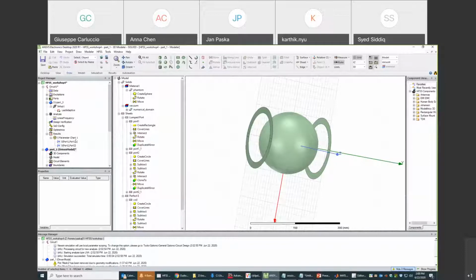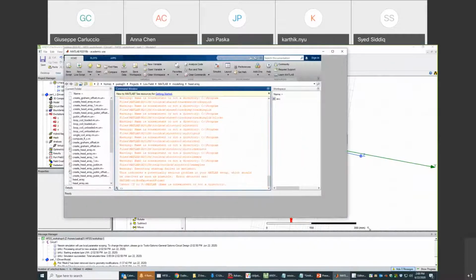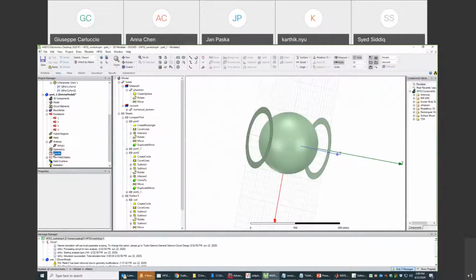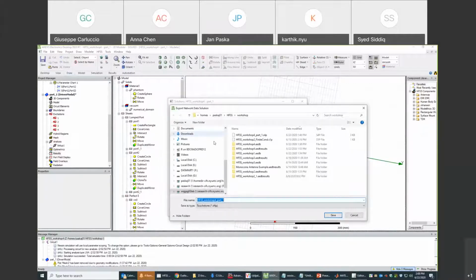And I simulated it, and it gives an S matrix. We can have a look at that S matrix, how that looks. Maybe in MATLAB is easier for me. So I exported that S matrix. We discussed that already, but I'm going to show it again. I exported it by choosing results, then solution data, and then you can find here export, and you can just export the matrix data to a SNP file.